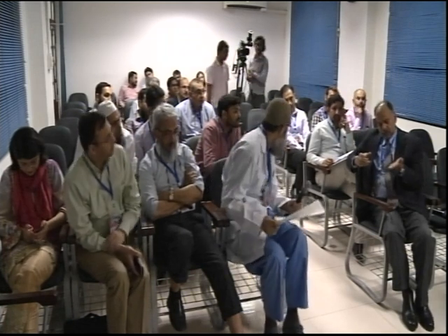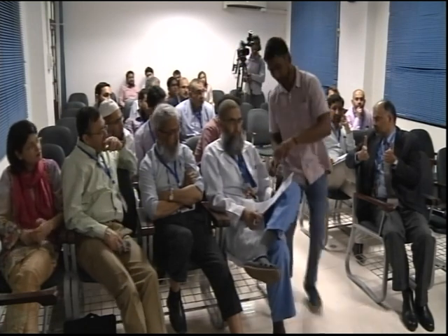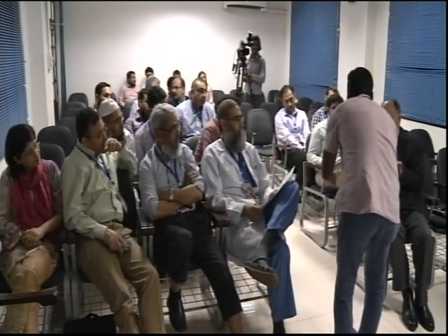So you have to be careful. When you go into the duodenum, what you need to do is keep the lumen in view all the time. Once you go into D1, D2, raise the scope and then rotate it without locking it, and never rotate the scope until you are in the duodenum. Don't do right-left until you are in the duodenum.